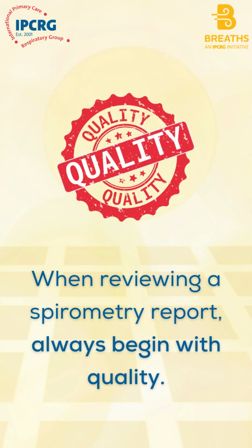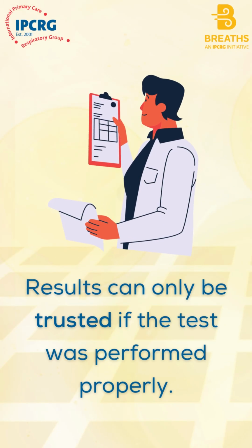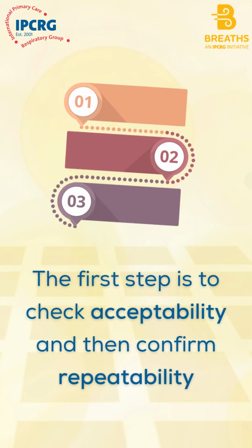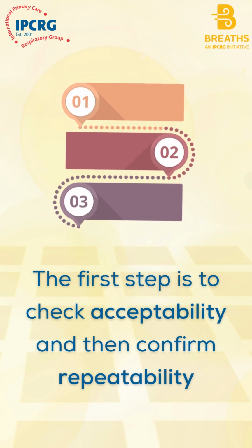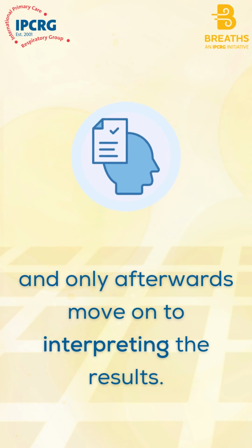When reviewing a spirometry report, always begin with quality. Results can only be trusted if the test was performed properly. The first step is to check acceptability and then confirm repeatability, and only afterwards move on to interpreting the results.